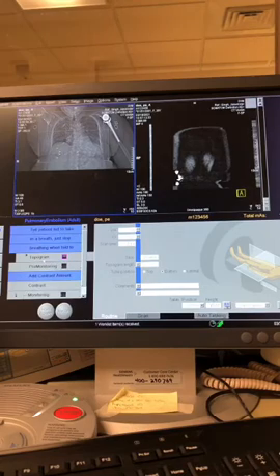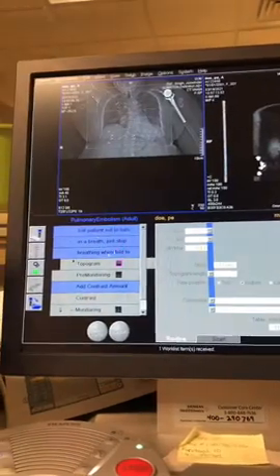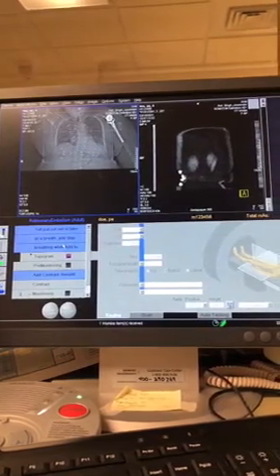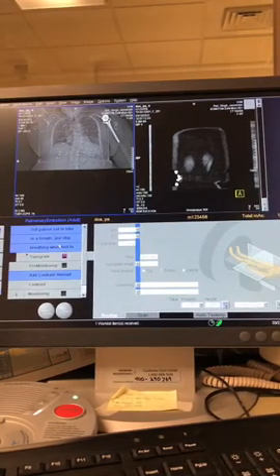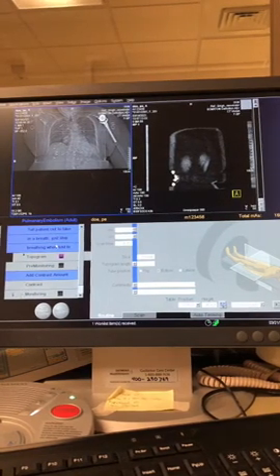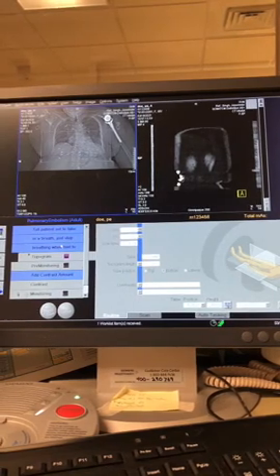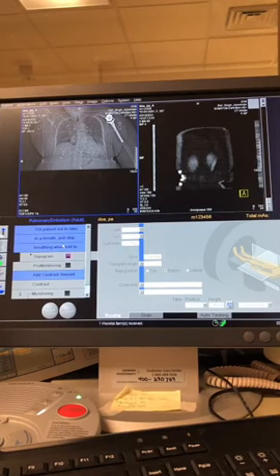So there's a lot of moving pieces. I want you to first just take a look here where it says, tell the patient not to take in a breath, just stop breathing when told to. So what we ran into is we found that the machine comes on and says, take a breath, hold your breath. What that was doing was actually increasing the pressure within the thorax and squeezing the contrast out of the vessels of the pulmonary arteries. And so it was washing out our PE studies, and they didn't get these big, bright, beautiful pulmonary arteries that they need in order to diagnose a clot within the pulmonary arteries, okay? So that's the first thing. But yeah, so I'm gonna walk you through the protocol.